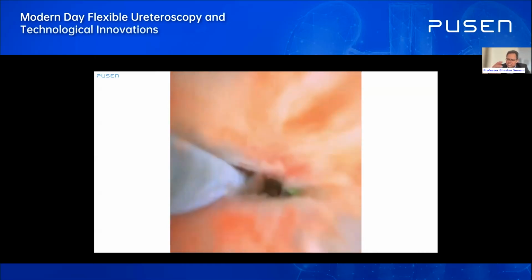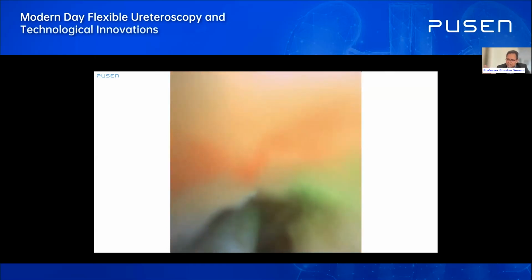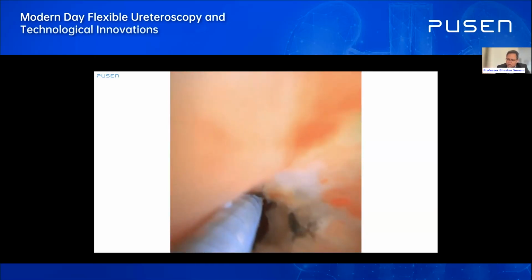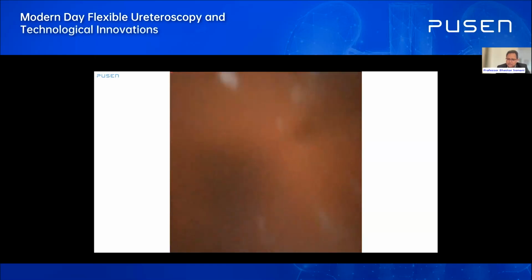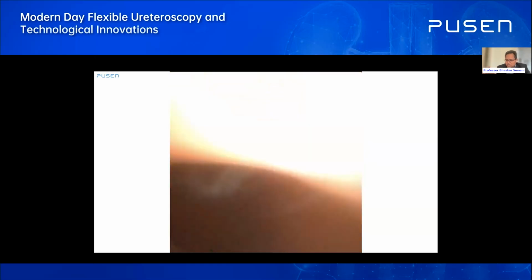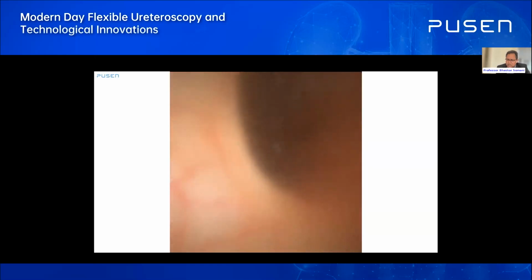Once you did that, you would see there's a lot of debris in the kidney, as you'd expect, because of the narrowing. With suction, normally what you would have used is a syringe or something like that. With suction, it was easy to go in and clear, as you can see here. So again, there's a lot of floating debris. With suction, it was easy to clear. So it avoids you syringing and so on. Once you did that and decompress the kidney, you will see the stone in the lower pole. And then you can treat the lower pole stone as you would normally do with your laser, any laser. Once you have treated that, here you can see we're just clearing all the debris.